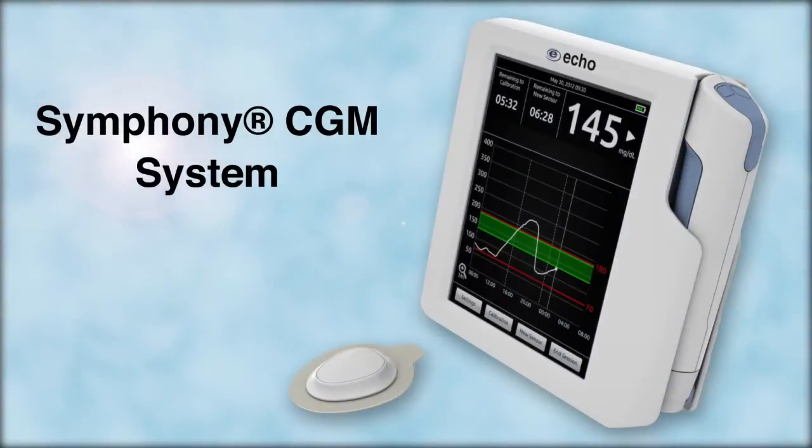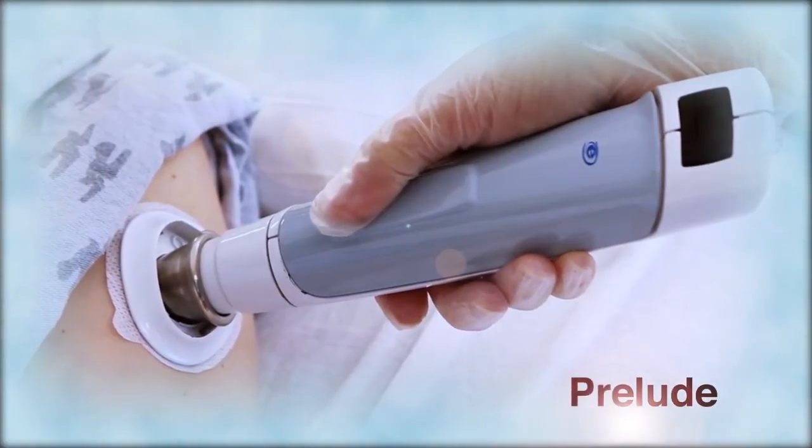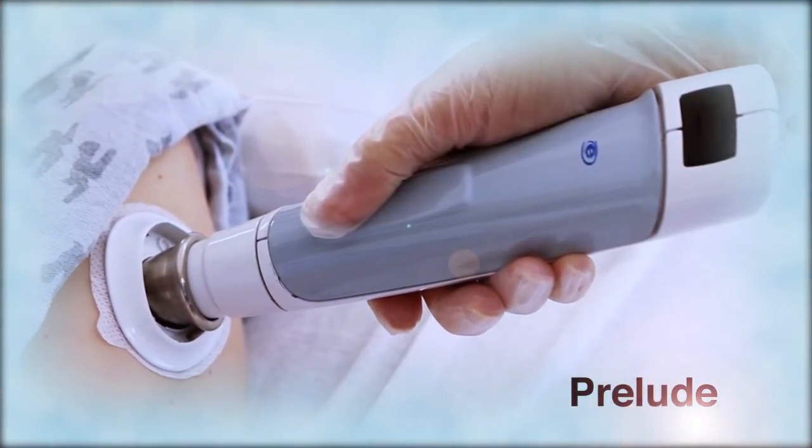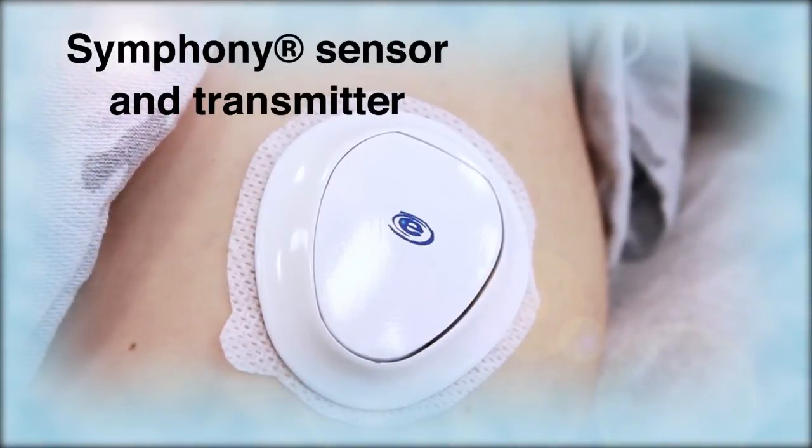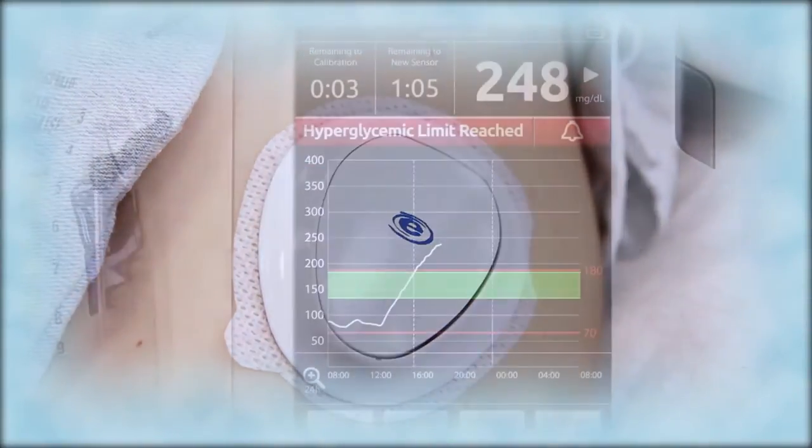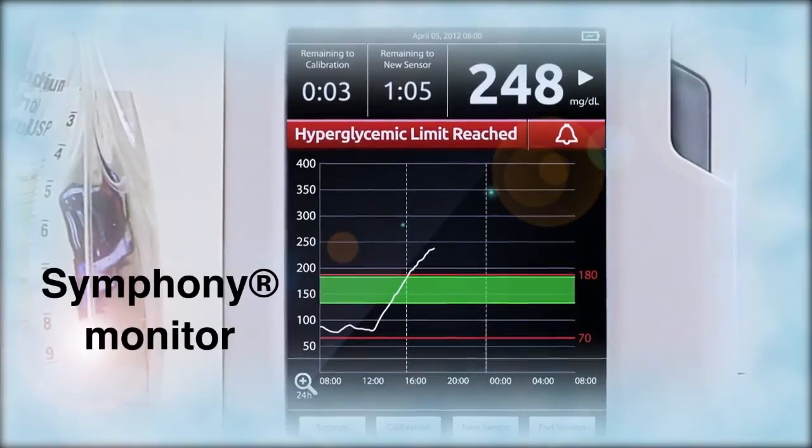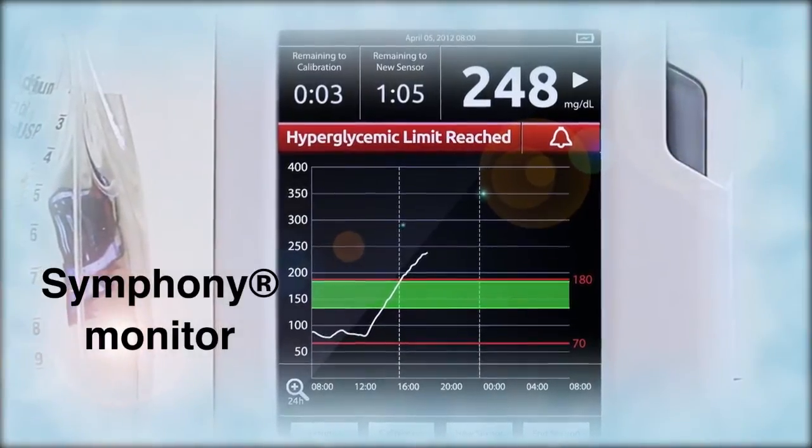The Symphony CGM system is comprised of three integrated components. Prelude, which prepares the skin using microdermabrasion. The Symphony sensor and transmitter, which measures glucose. The Symphony monitor, which receives and displays the glucose values.